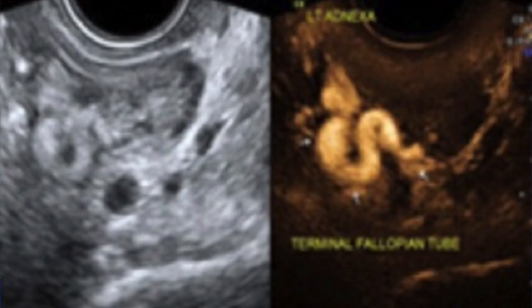This is another case of a left hydrosalpinx showing a beaded appearance. This is the terminal fallopian tube. And a delayed spill was seen after about 5 to 8 minutes, and a delayed peri-ovarian diffusion.